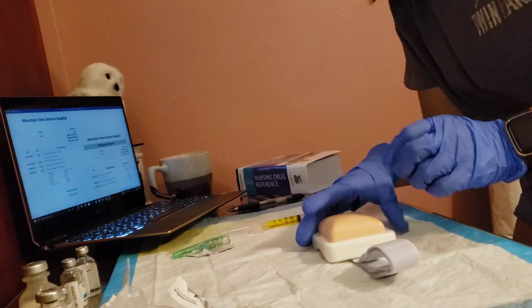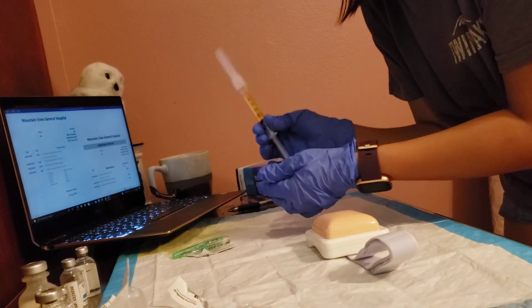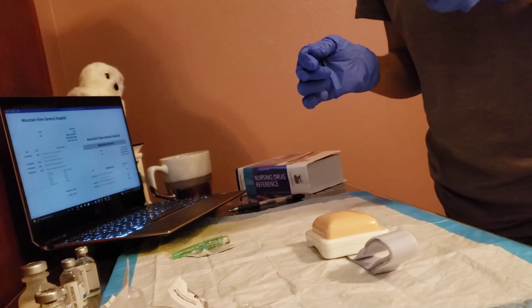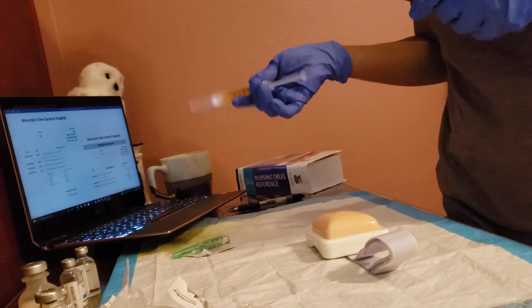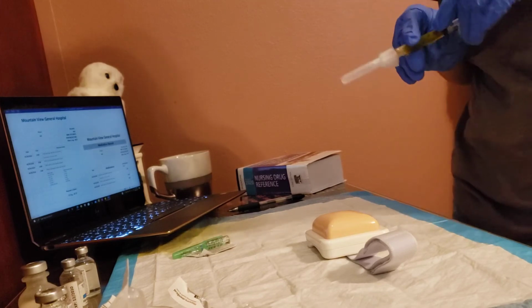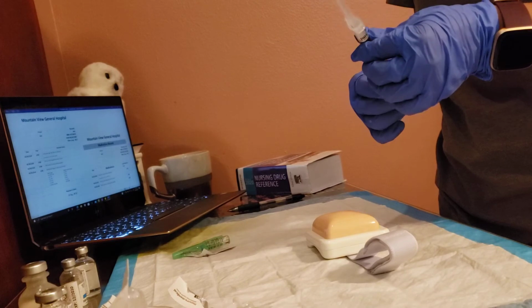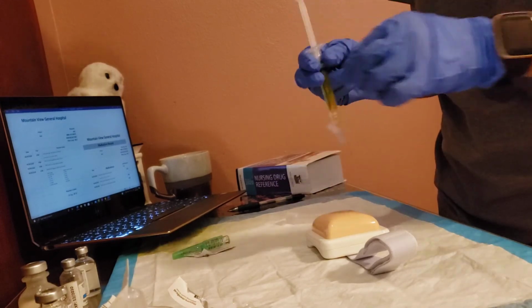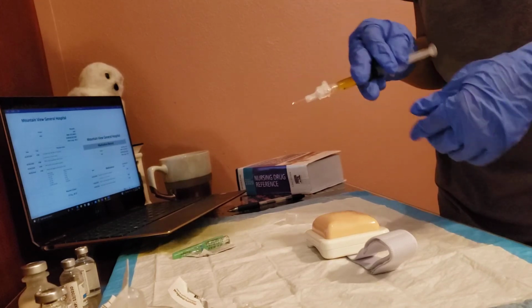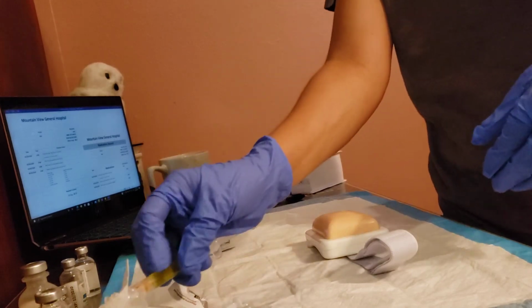So I'm gonna look at my order again, and I'm gonna see that my antibiotic is 2.5 ml. I'm giving my full gram of the powder in here, and so I'm gonna want to go to his vastus lateralis, or his ventrogluteal area, and I'm gonna go at a 90 degree angle, and I'm gonna give slowly. Okay, so I'm gonna just take this off, and I'm gonna inject slowly, and then I'm gonna just put my safety on, and I'm gonna give him that med.